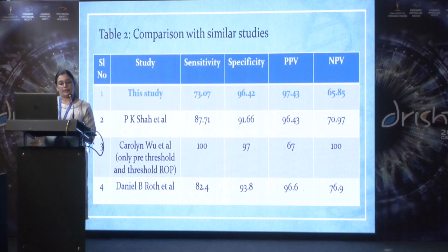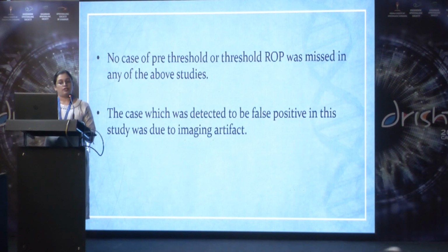The study conducted by Caroline Wu et al. considered only the pre-threshold and threshold ROP, and the sensitivity was found to be 100%. No case of pre-threshold and threshold ROP was missed in the above study, and the case which was detected to be false positive in this study was due to an imaging artifact.